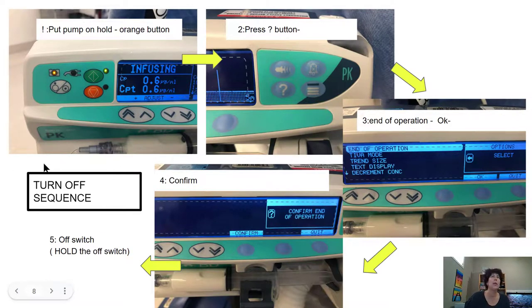So how do we run the turn-off sequence? This is actually pretty tricky, so pay attention. Number one: put your pump on hold by pressing the orange button. Then press the options button — the question mark — and you'll get a menu come up. Press 'End of Operation' and press OK. It will ask you to confirm again, then confirm. Once you've done all of that, you can switch the pump off by holding the off switch.